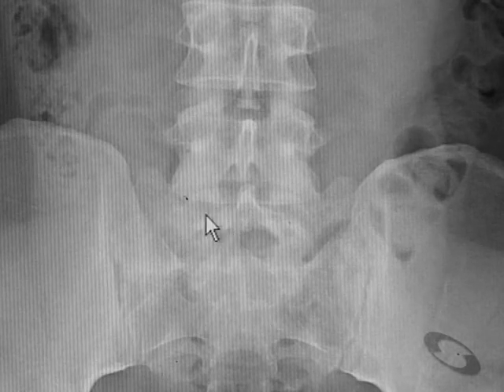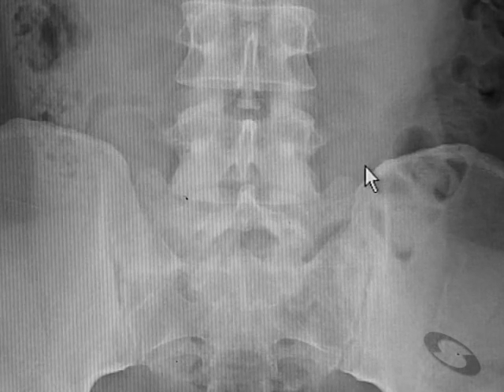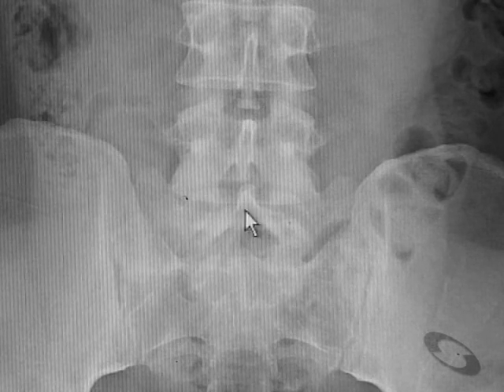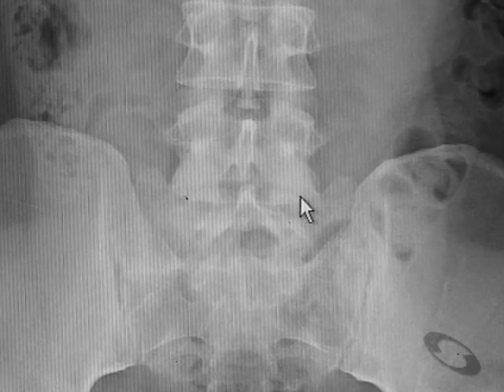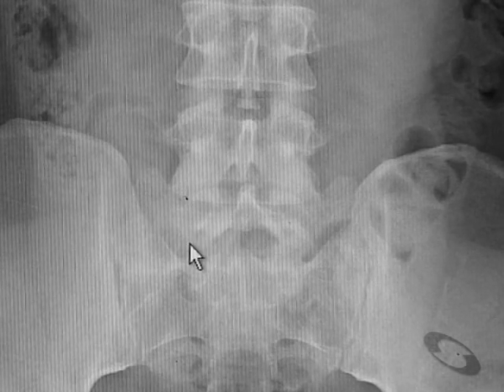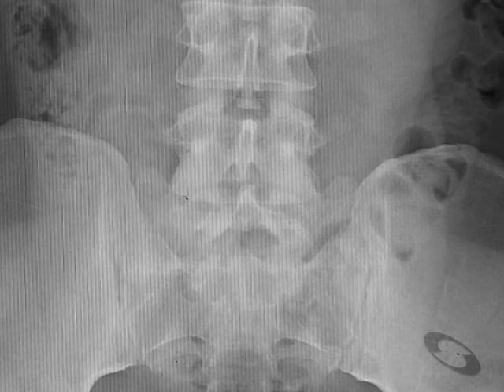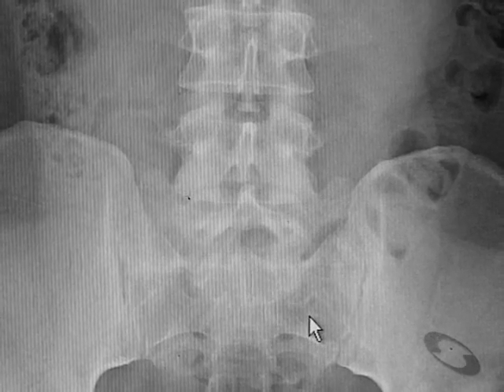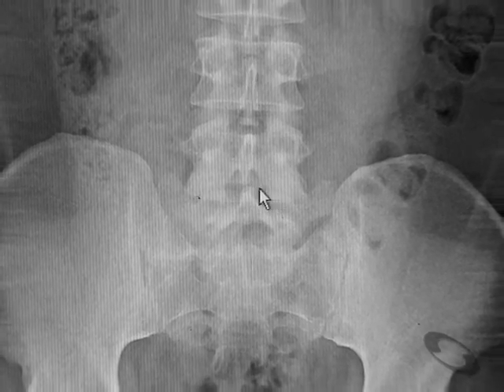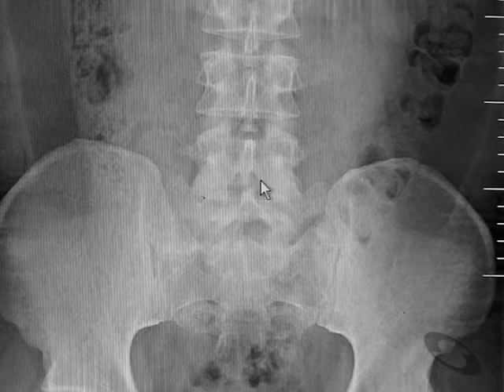This is the AP view of the patient's lumbar spine and pelvis, normal iliac crest height, and you can see that the height of the crest is considerably higher than the L5-S1 disc space, which is right here. This disc space is the vestigial S1, S2. The patient has normal alignment. Hips and pelvis are otherwise normal. In the operative procedure that we'll video today, we will be putting an intervertebral cage in at L5-S1, and the coflex-F device will go between the spinous processes at this level.